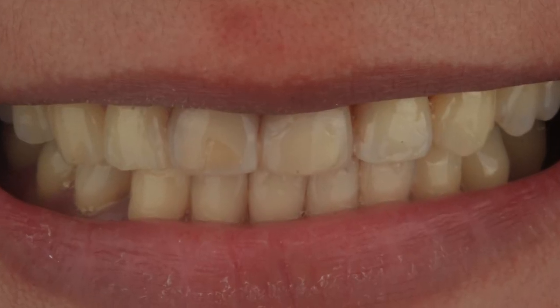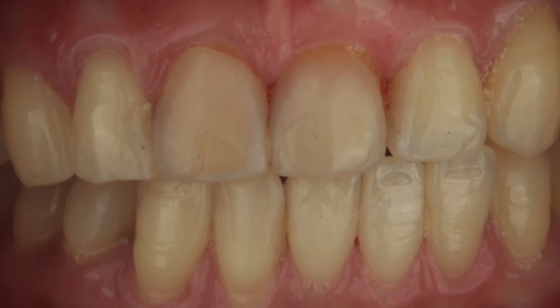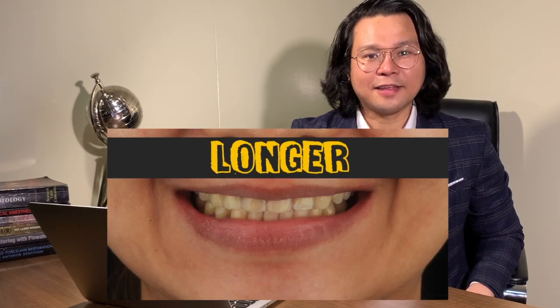So this patient in her early 30s went to my clinic with a chief complaint of having this old restoration on her two front teeth. It's very obvious, very apparent that she wants it to be changed and fixed. But as we talked about the case, she also wanted to enhance the color and the length of her teeth.